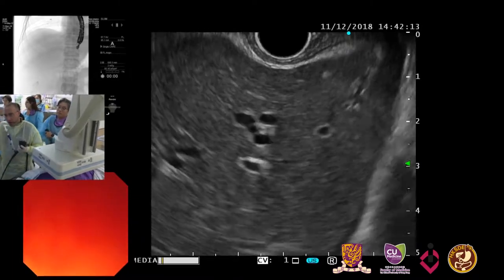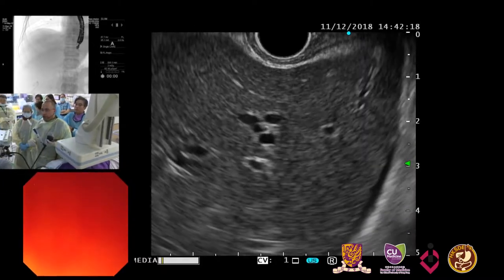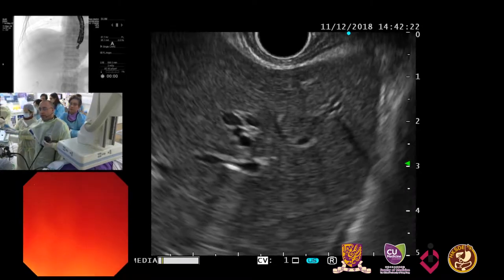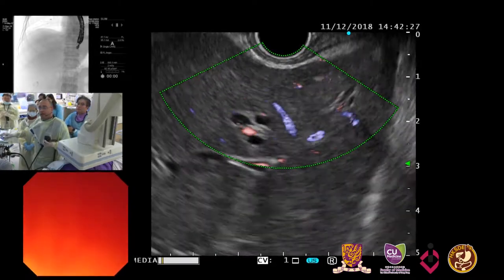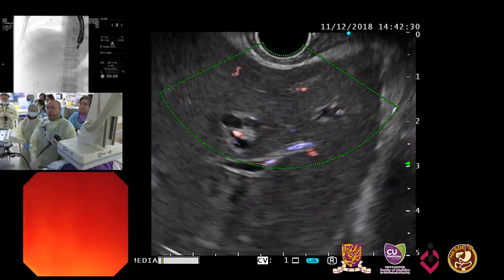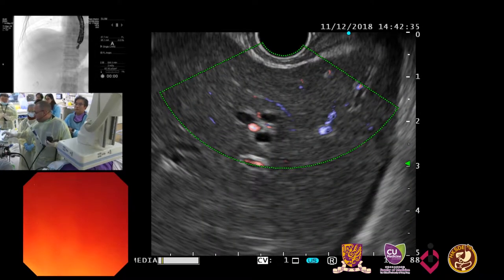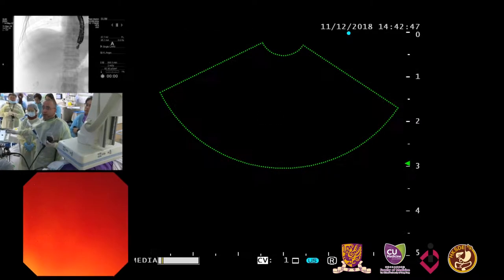Okay, so we're looking at the left lobe here. We're just under the gastroesophageal junction. The B2 segment, and let me look up some. This is the Doppler on, and we can see a mildly dilated left intrahepatic duct. So it is about 3.5 to 4 millimeter.